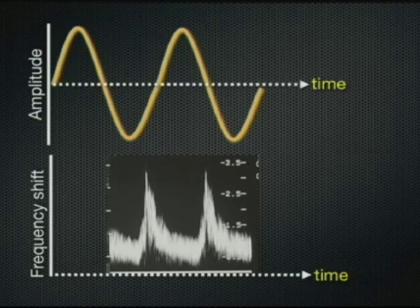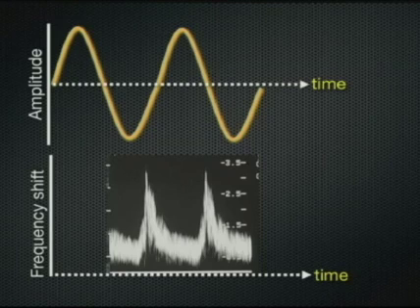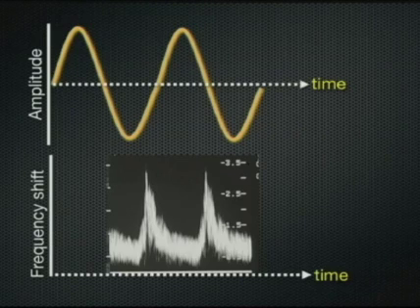Remember, ultrasound is simply a change in pressure amplitude over time. The way that we convert a frequency displayed in terms of amplitude over time into a spectral display, in which we are looking at frequency shifts displayed over very short intervals over time, is by a process called Fourier transformation.